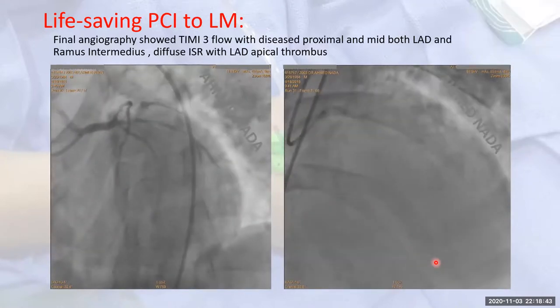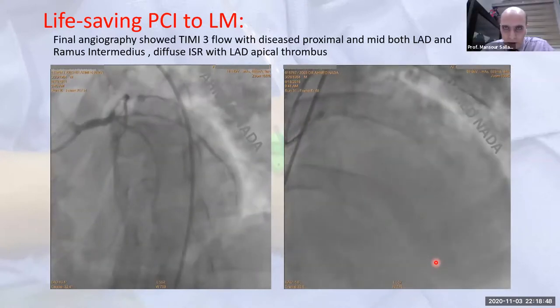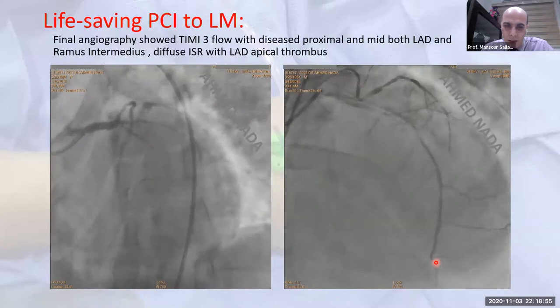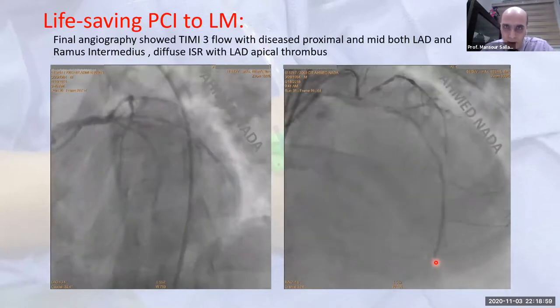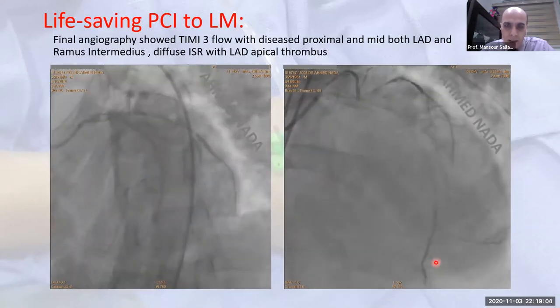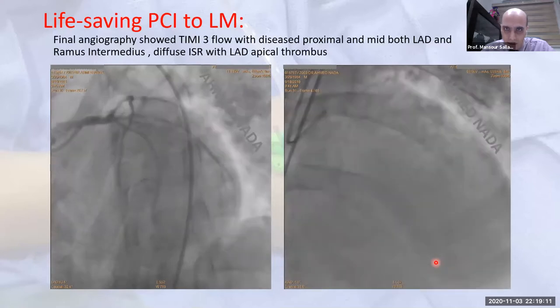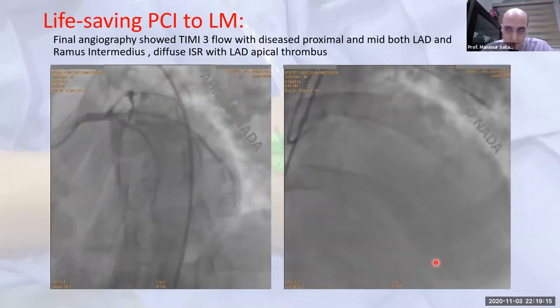Perfect. Dr. Mansour, I do agree with this strategy right now, just to stop here. We have almost TIMI-2 to TIMI-3 flow. The patient is hemodynamically stable. So I think I will put this patient on a glycoprotein 2B3A receptor antagonist for 18 or 24 hours and reassess the patient. Or if the patient collapses or becomes hemodynamically decompensated, I will take the patient and recanalize the LAD, because almost all of the disease is in the LAD. So a conservative strategy, I think, is warranted in this situation.